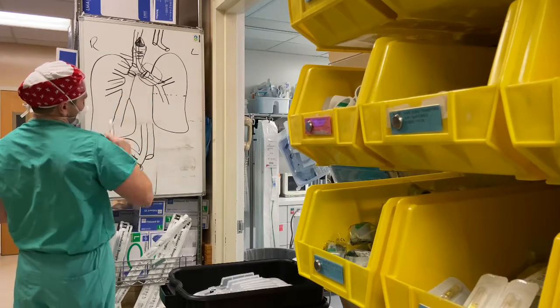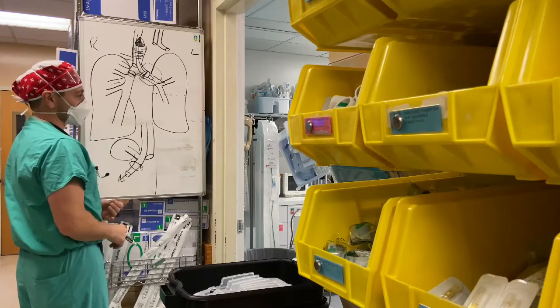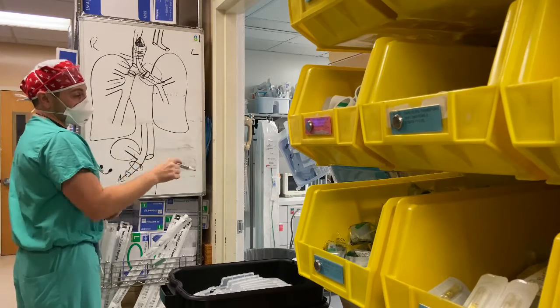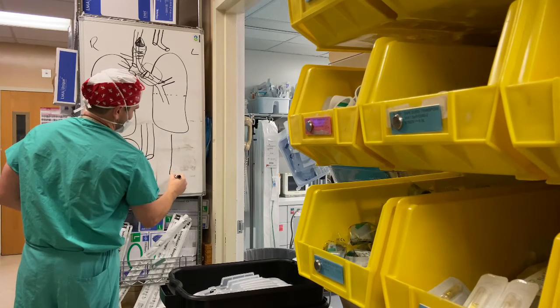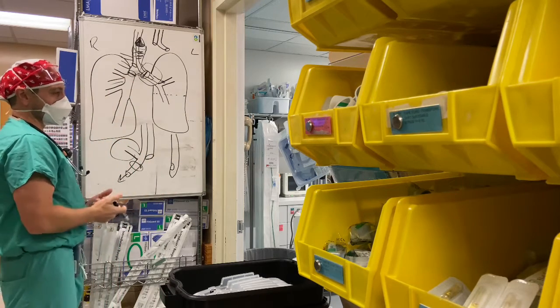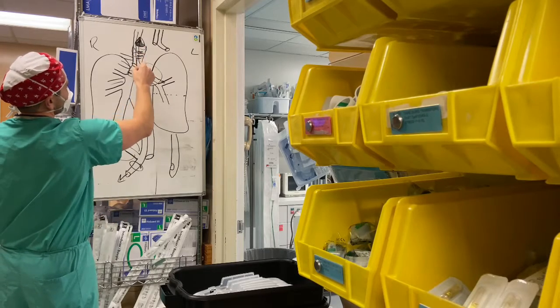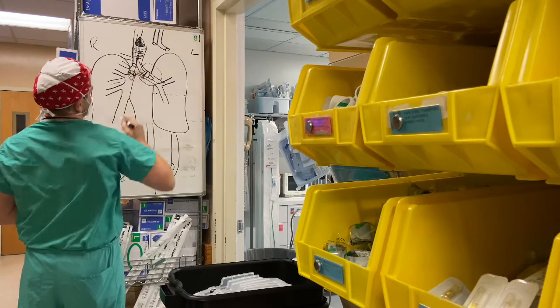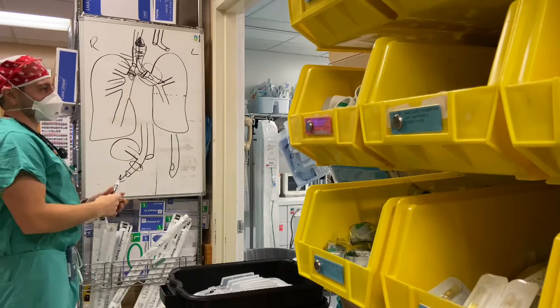So the number one reason we use a left-sided tube is because it's easier to place. And to be more specific, the reason it's easier to place is because we always have to consider the takeoff of the right upper lobe. If you look at a regular, just single lumen breathing tube, there's always a hole right there called a Murphy's eye. And the idea is that if your tube's a little bit too low, say the tip of your single lumen tube is right here, your kind of right main stem, that Murphy's eye is still going to allow you to get air up into that right upper lobe.